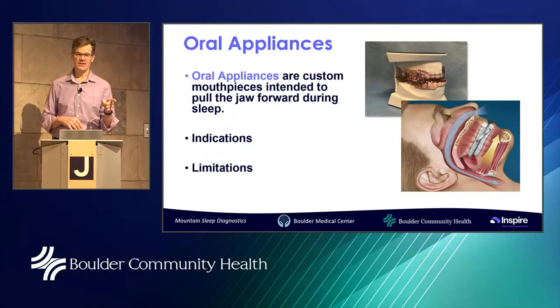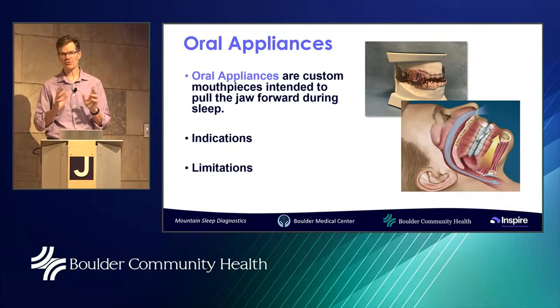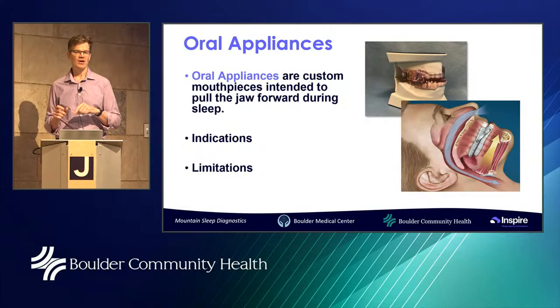The CPAP devices, I would say they work about half the time, so it's not unreasonable to try CPAP for central sleep apnea. It's not as likely to work as it is for obstructive, but I'd say roughly half the time it'll help or it'll be effective therapy. If that's not effective, there's a more sophisticated version of CPAP. Looks the same box, but it's got much smarter brains in it. It's called adaptive servoventilation, and that's very effective at treating central sleep apnea.